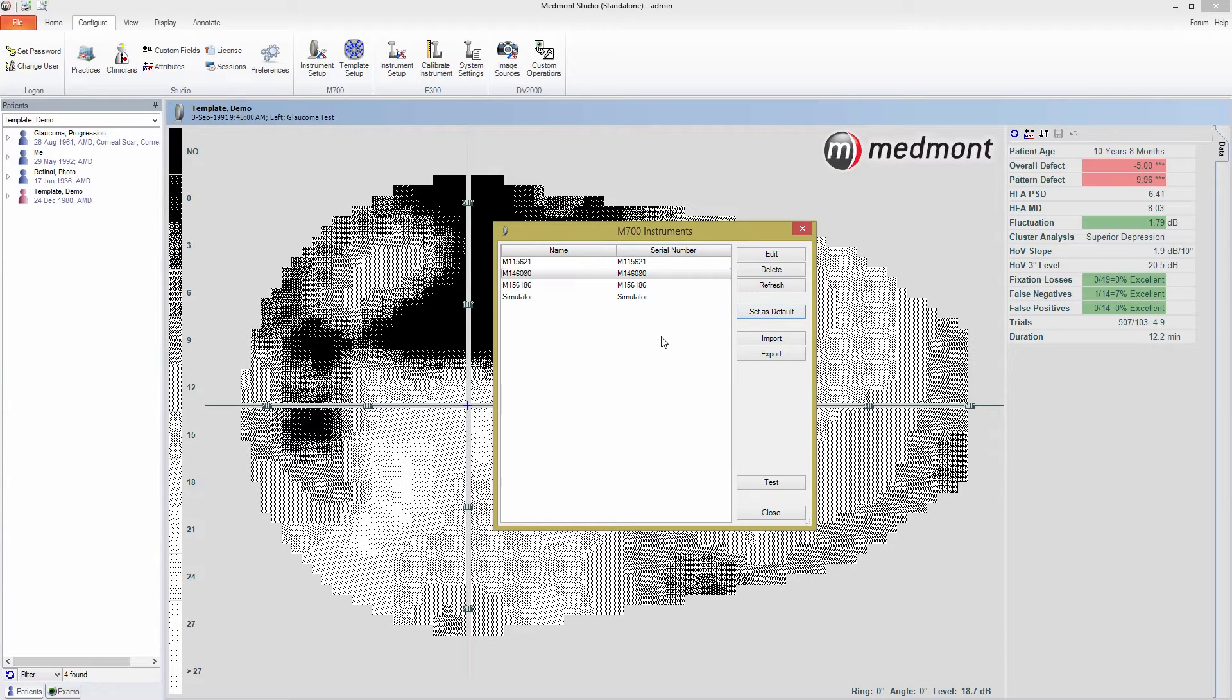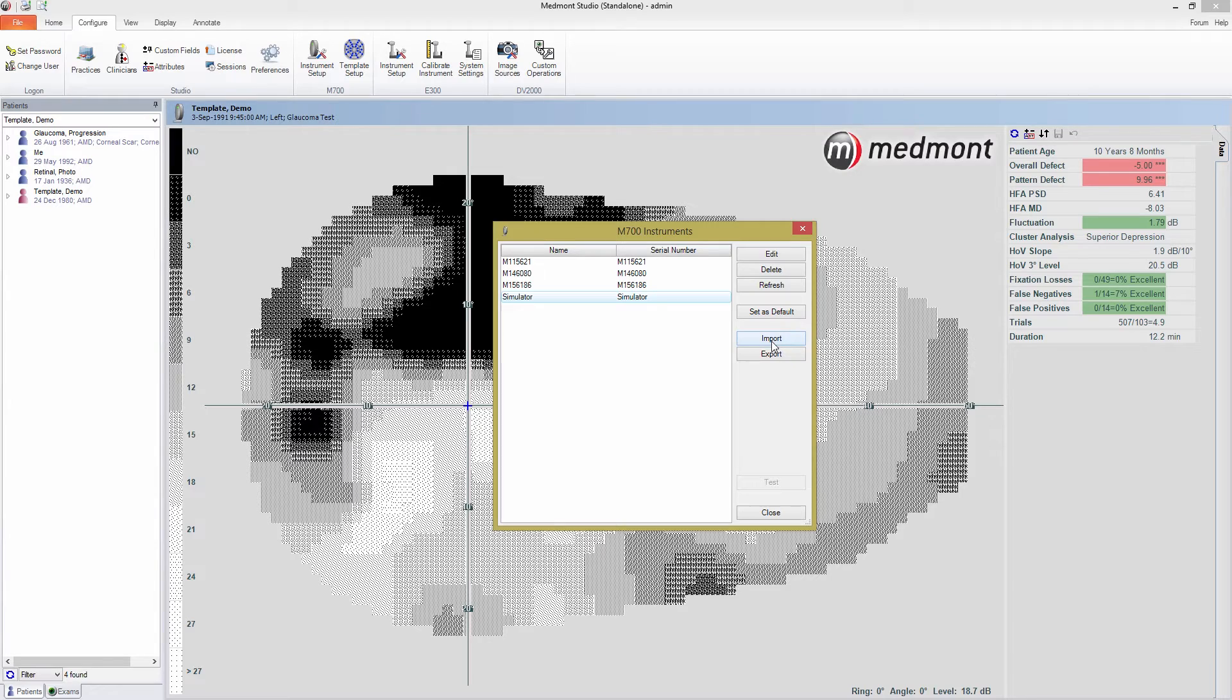If you haven't installed the perimeter yet and want to use the simulator, you can install it the same way. Just press Import and browse to wherever you've stored the simulator file. I'm going to close this down now and move on.